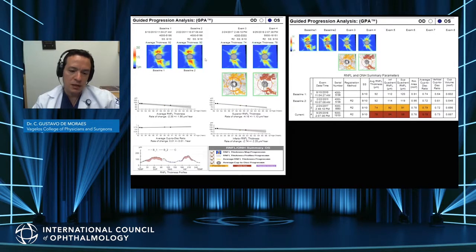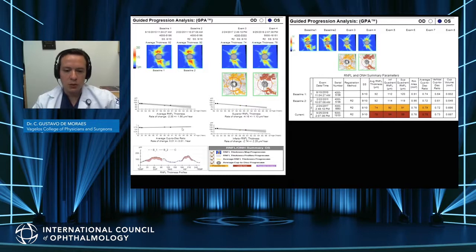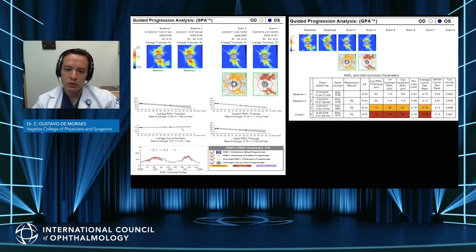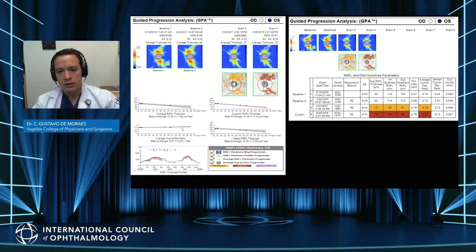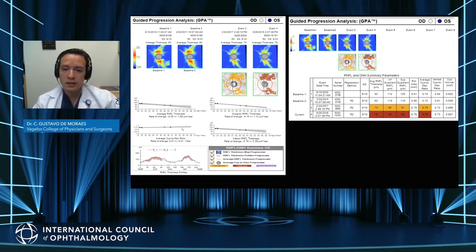For example, this patient is progressing relatively fast at 2.3 microns per year. We can also look at the superior and inferior parts of the retinal nerve fiber layer and the cup-to-disc ratio. I find it particularly important to look at the topographical map to see where the change is occurring. Glaucoma tends to affect mostly the superior and inferior poles of the disc, so I look for changes in those locations. Changes in the nasal part of the disc are not characteristic of glaucoma if they happen in isolation.